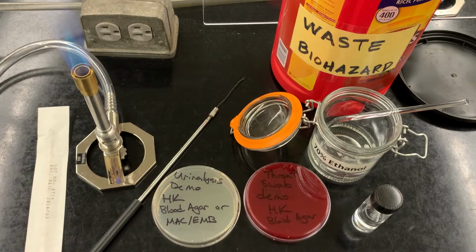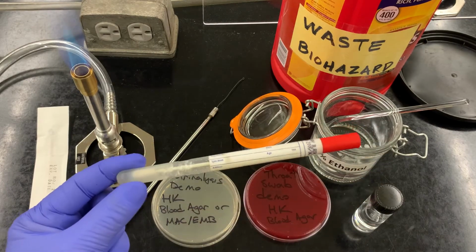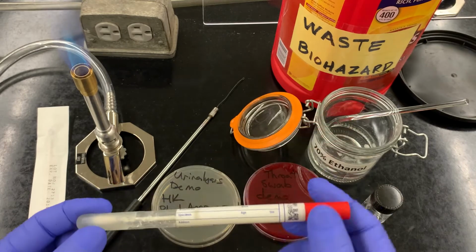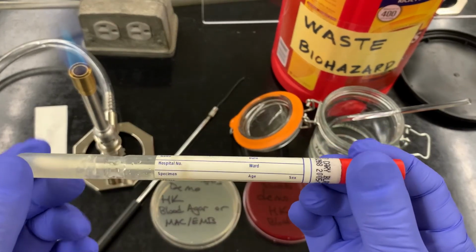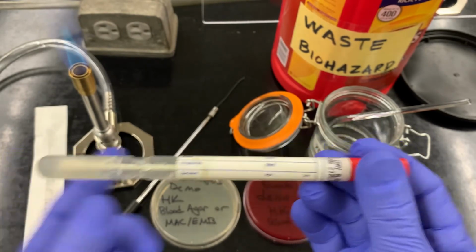For a throat swab, it's very rare for the swab to go straight onto media. We are going to do that in the class, right? But generally, when you get your culture, we're going to use something like this. This is called transport medium, right? And this is a really nice, convenient way to get your samples, right? Because we have a nice labeling system here. I think now they even use stickers.